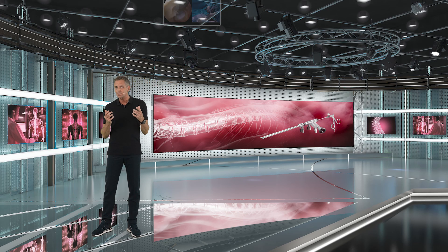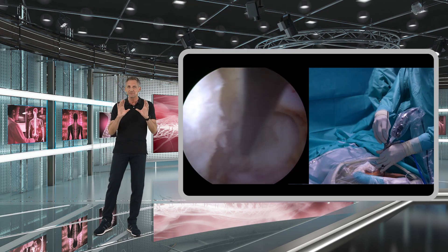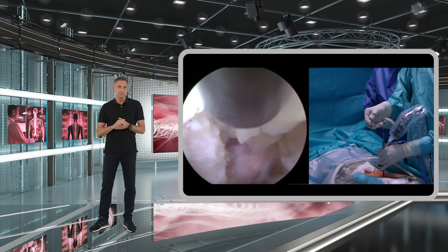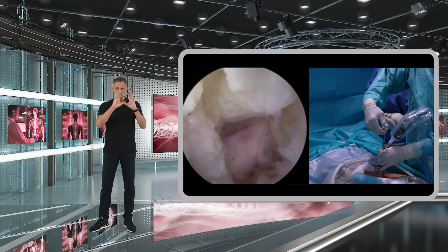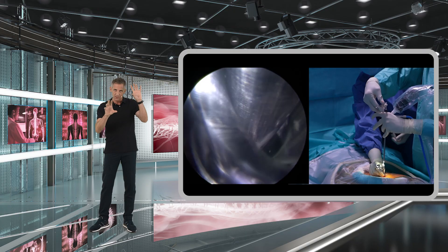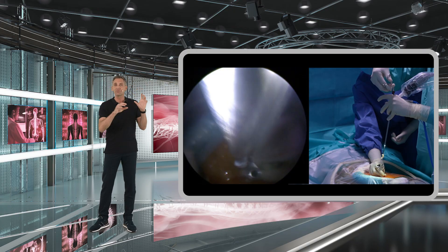If this is not possible, you may have to go through the axilla — which is possible of course — but just make sure that you have clearly identified all the neural structures: the dura, the nerve, the shoulder of the nerve, and the axilla itself.